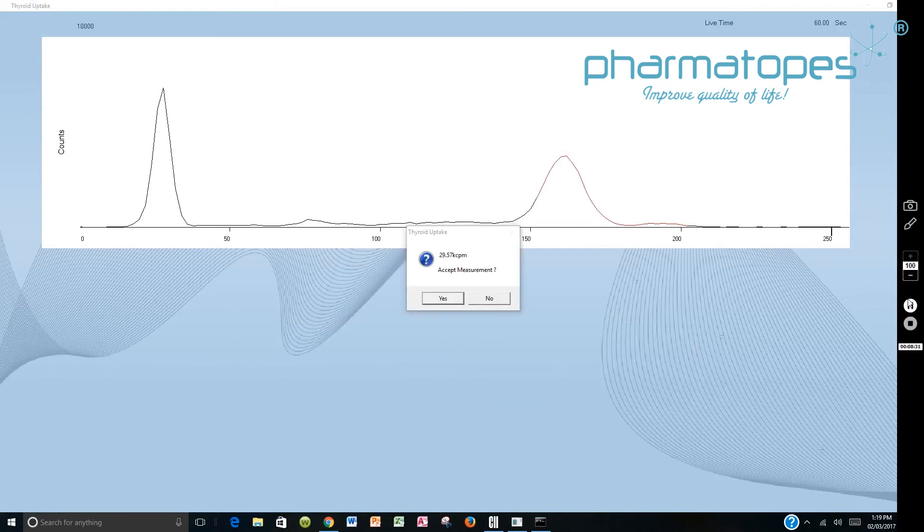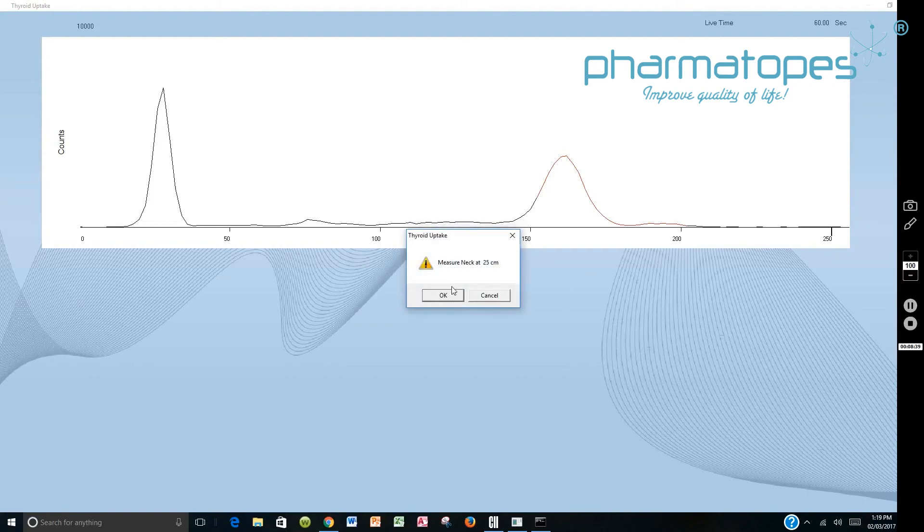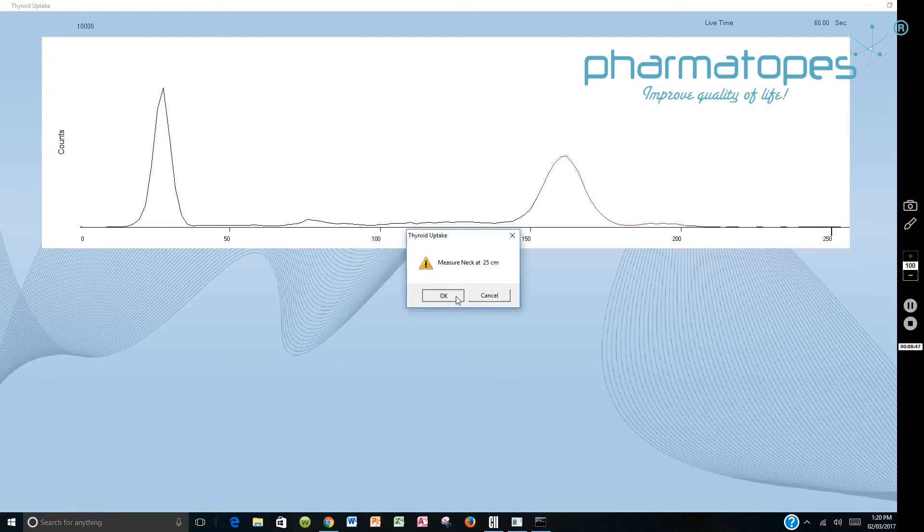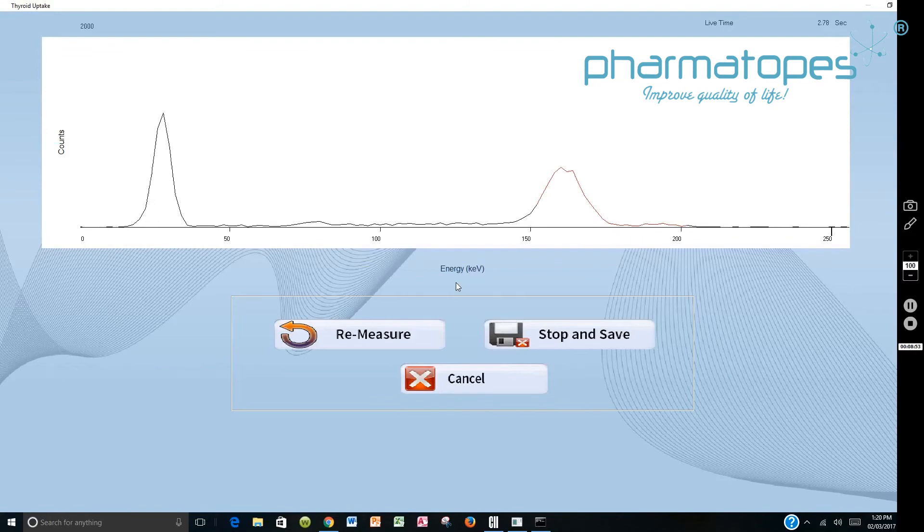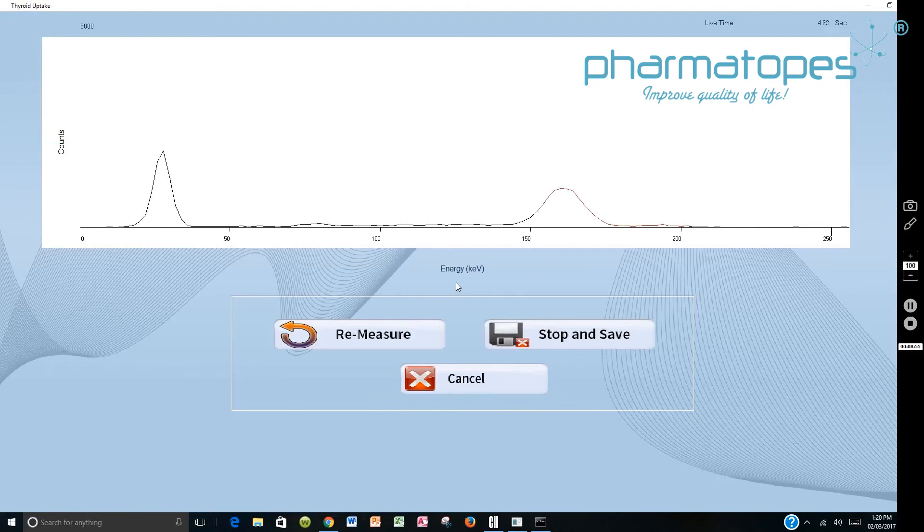Once the patient's background has been counted, you can review the spectrum and then you can accept that measurement. Now you're asked to measure the neck at 25 centimeters. So we'll begin the neck count by just saying OK after we've positioned the patient in front of the probe with the proper distance. And then the instrument will count for one minute.